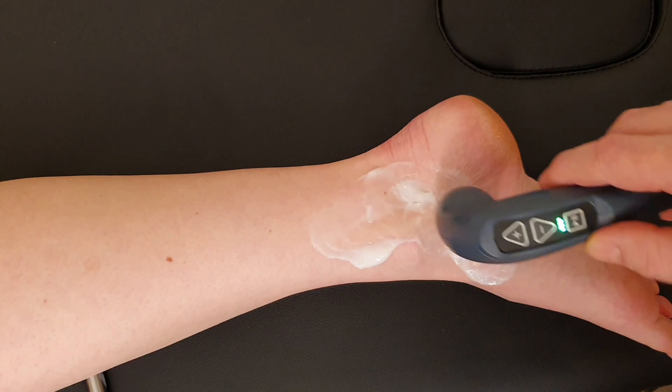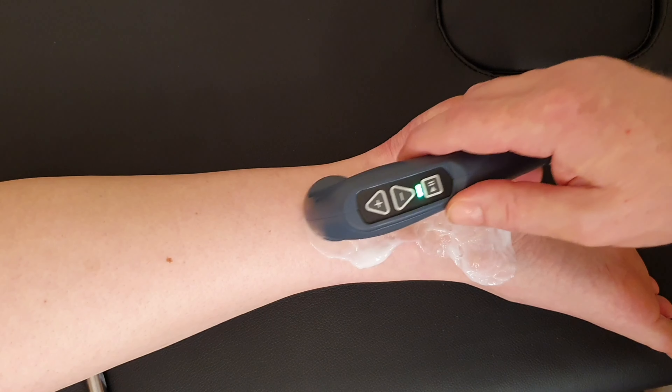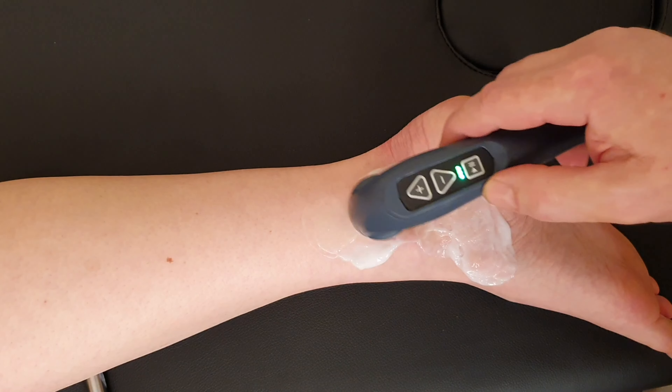As this is a long video, I'll cut now to the end so that you can see the results rather than sit through the full treatment.